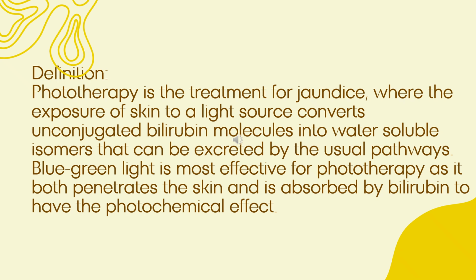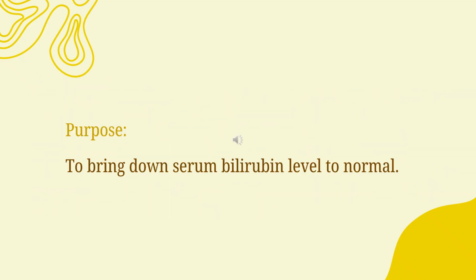Blue-green light is the most effective for phototherapy as it both penetrates the skin and is absorbed by bilirubin, having the photochemical effect. Purpose of phototherapy. Mainly the phototherapy is given to bring down the serum bilirubin level to normal level.